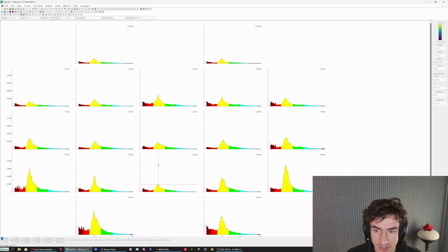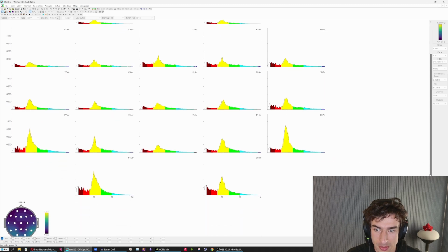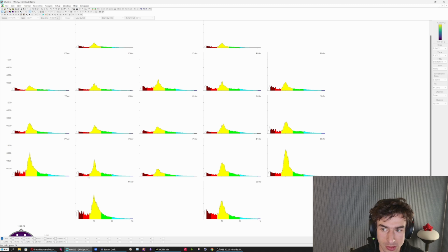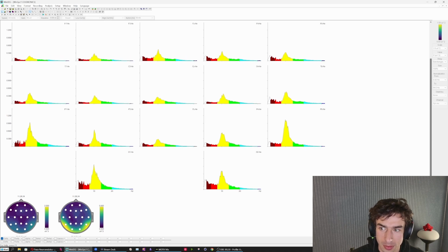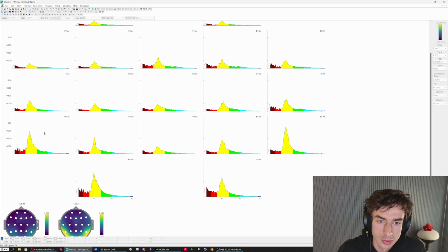So it looks like the biggest peak that we see at PZ is here at 10.25 hertz. And then I'm also going to pluck out the slower edge of alpha at 9.03 hertz. And we can see this jagged appearance here because of the spiky nature of some of the activity that we saw originating from P7, which confuses the fast Fourier transform.